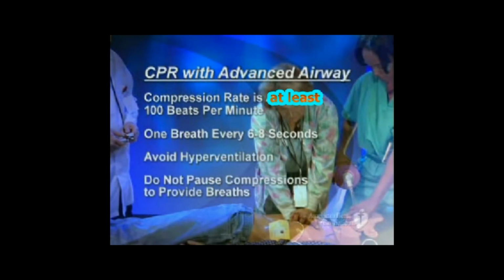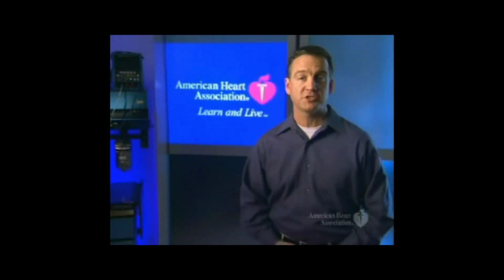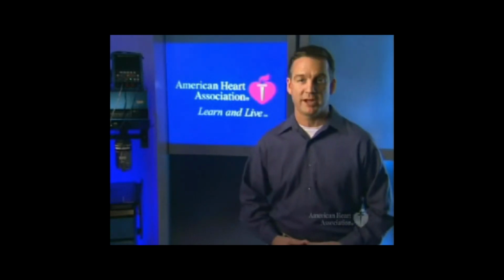without pausing for ventilation. However, ventilation changes to 1 breath every 6 to 8 seconds, about 8 to 10 per minute, being careful to avoid hyperventilation. Also, there is no pausing to provide breaths. Compressions continue as breaths are given. The following scene in progress demonstrates the differences when performing CPR on a victim with an advanced airway in place.